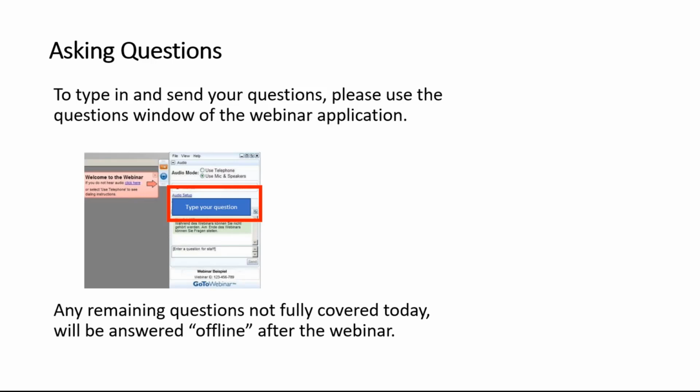I see another question. You have presented different approaches and you were also talking about microsecond pulsing. So in which cases do you decide to use subthreshold treatment versus threshold?